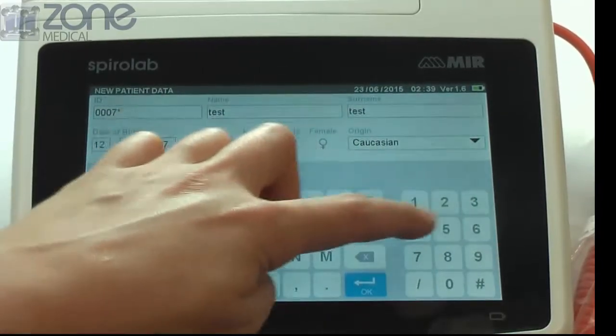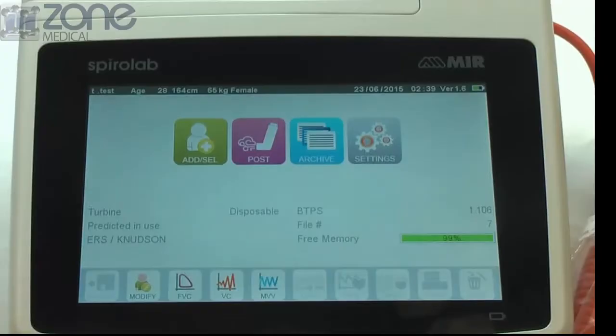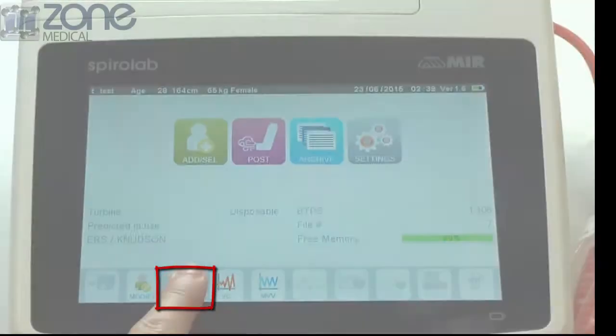You may then press save and exit and all patient details will appear at the top of the page. Press FVC to measure the forced vital capacity.